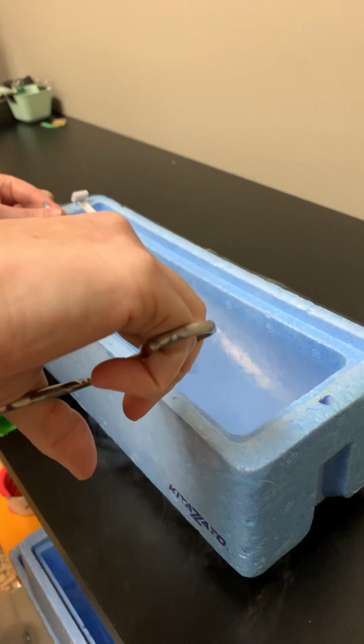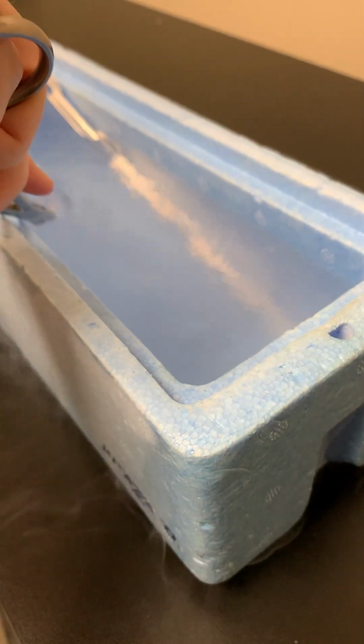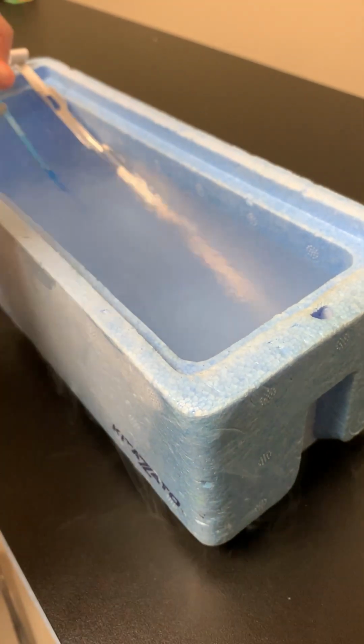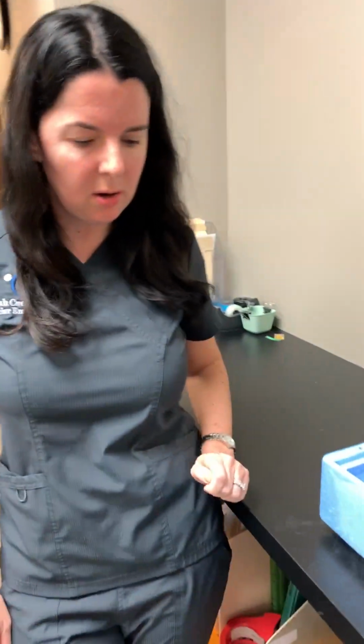So that's our freezing and our thawing, pretty much. And you see the metal bubble against this forceps that I just put in there because it's very cold. It's kind of hard to cap these underneath liquid nitrogen because you can't take them out. And then you take it and you slide it down into there. And then we would snap it in and we'd move it over to our big storage tank and we'd store it in there. Wow. And they can be stored indefinitely.